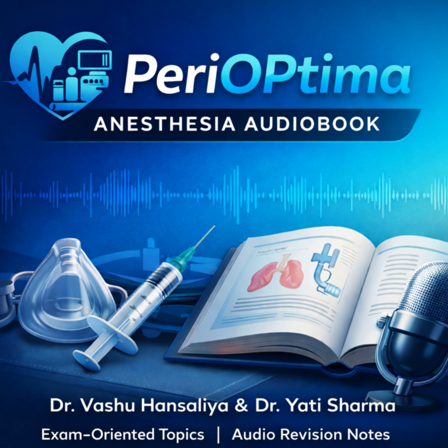VV indications are for pure respiratory failure. Severe ARDS. COVID pneumonia was a big driver for this. Refractory hypoxemia with the PF ratio less than 80 despite proning and paralysis. Or it can be used as a bridge to lung transplant.